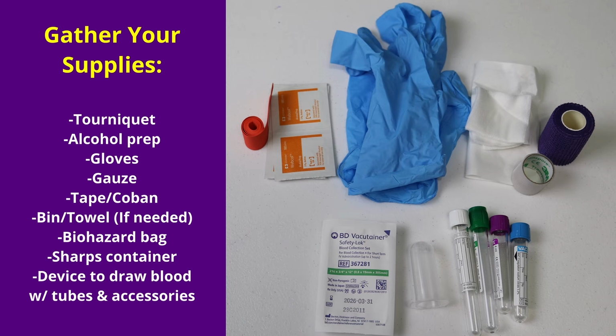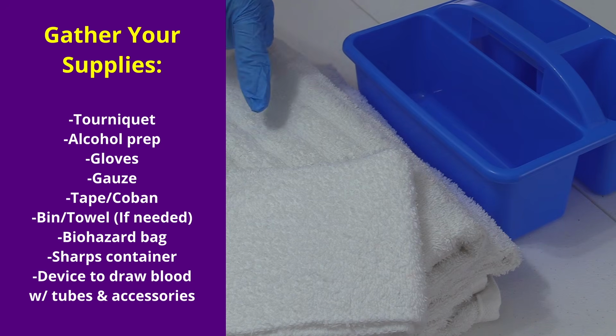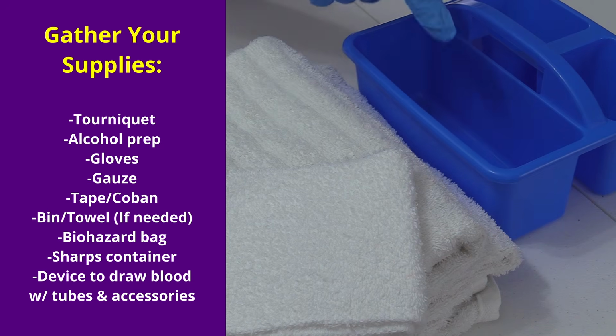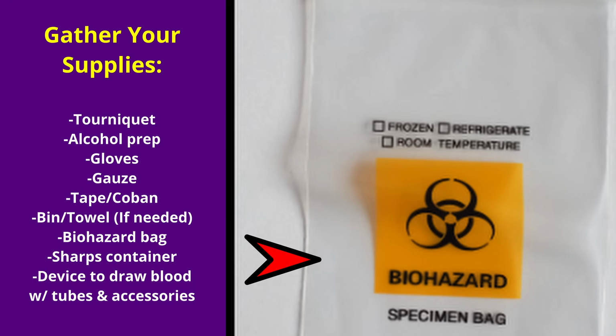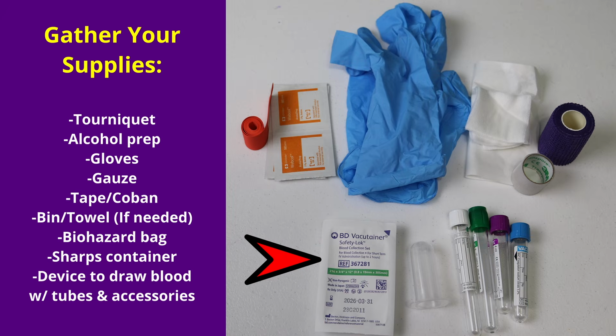After doing this, you'll want to gather your supplies. So what you need to collect before you actually start the procedure includes a tourniquet, alcohol prep pads, gloves, gauze, tape, or Coban. I'm also going to have a towel to help position the patient's arm and a bin to help hold the supplies, a biohazard bag, sharps container, and then the specific device you'll be using to draw blood. Here I'm going to use a blood collection set known as the wing butterfly needle set.